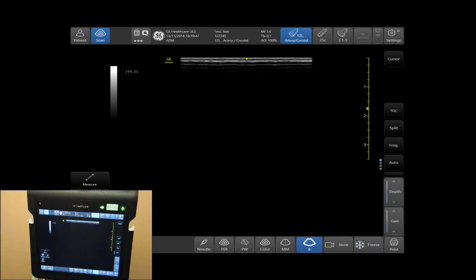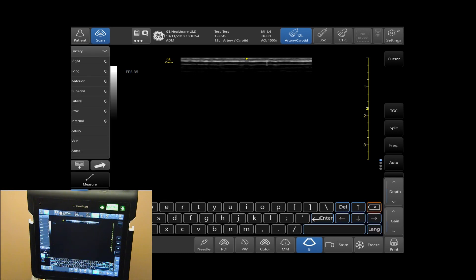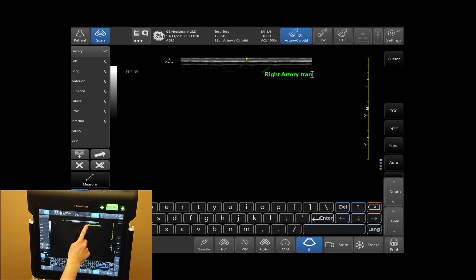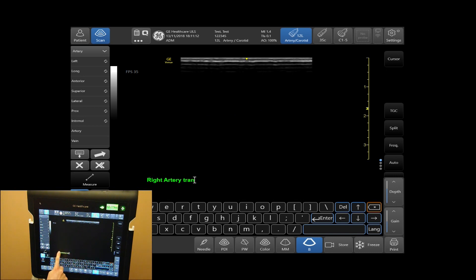To add an annotation, select comments on the bottom left-hand side of your touch screen. Choose comments from your annotation library. Choose a keyboard that populates upon selecting comments. You can tap and drag the annotation to its desired location.